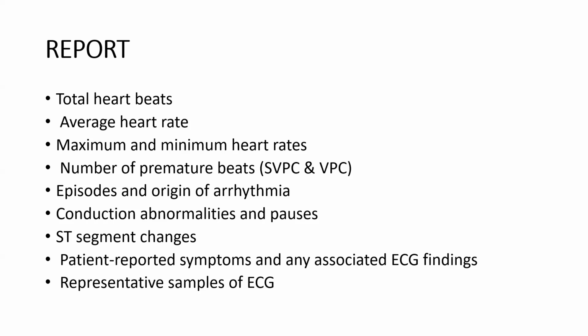Alternatively, the patient can be given a diary to write down his or her activities, the medication the patient has taken, and what the patient was doing. The time should be noted.